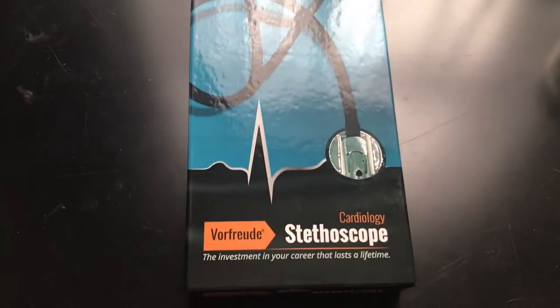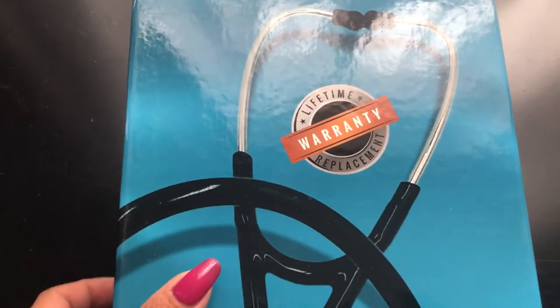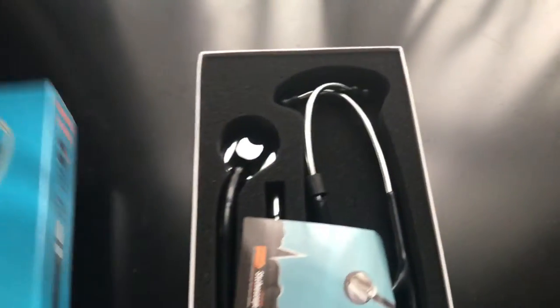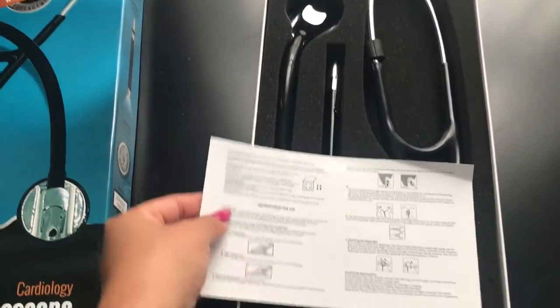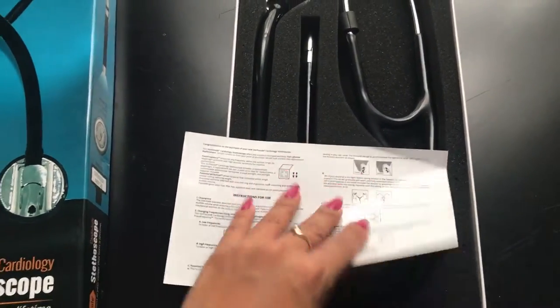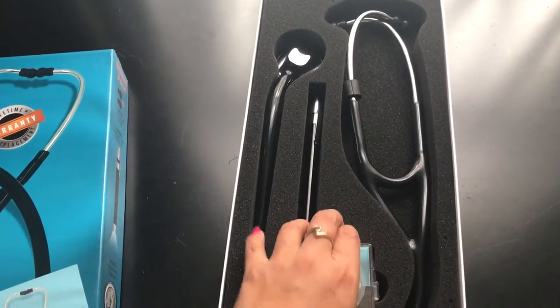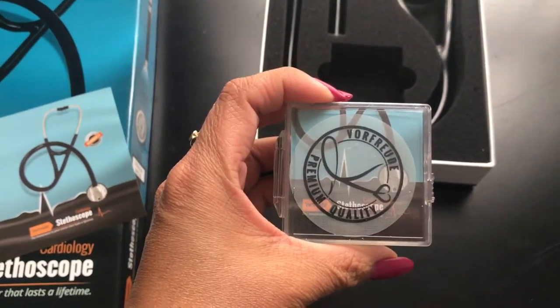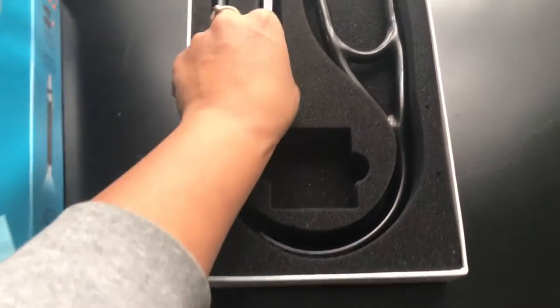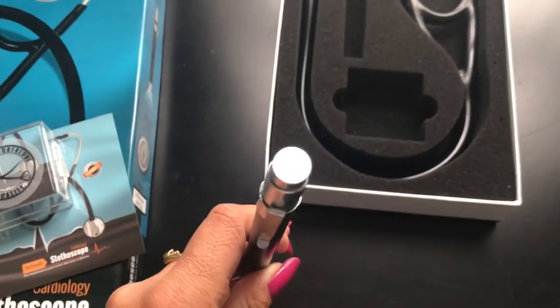This is the Vaufrid cardiology stethoscope. It comes with a lifetime warranty. Inside, it is packaged with instructions on how to use the stethoscope, and it also comes with extra earbuds and a pen torch.